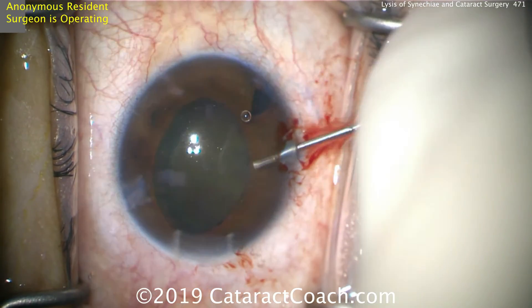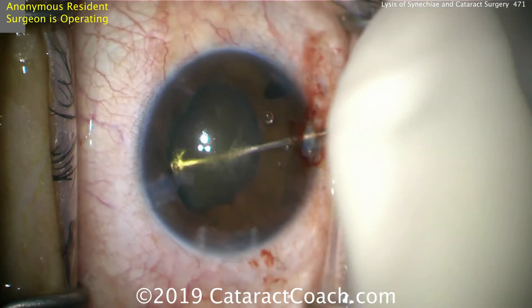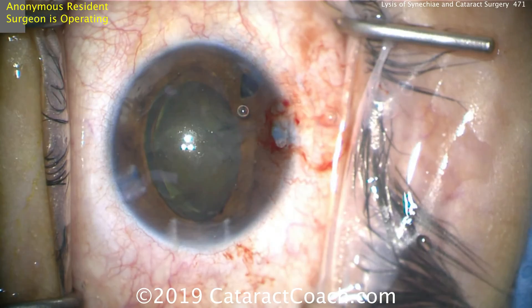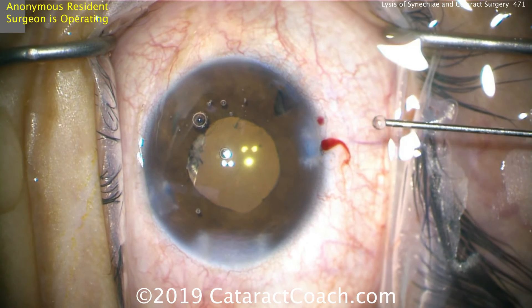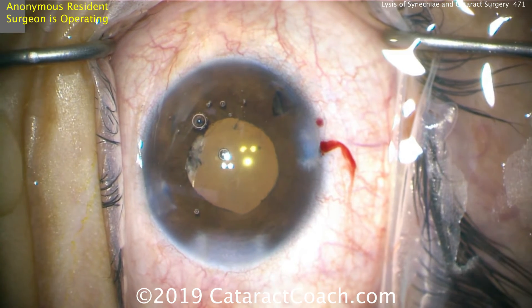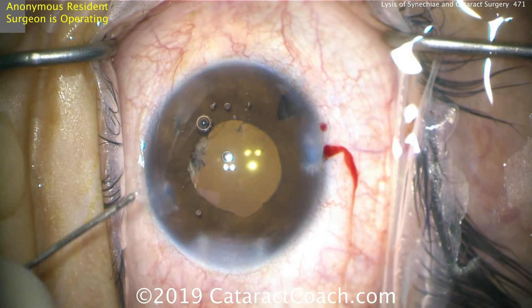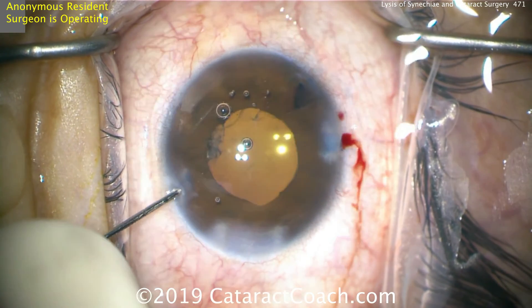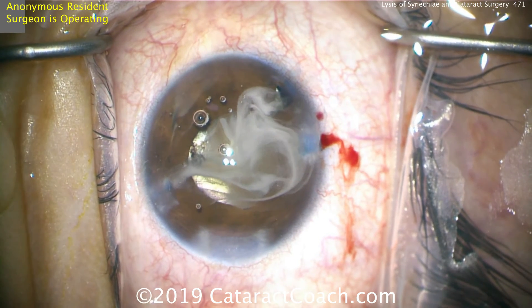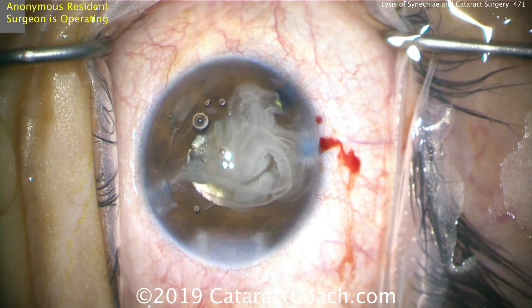Hydrodissecting out of the capsulorrhexis — let's really dial that nucleus up so it's held by the pupil and the iris at about the iris plane. That looks really good, and then it can be evacuated from the eye. Let's go to the end of the case. Sealing up the incisions — there's a little bit of membrane on the left side of the pupil, and we're going to leave that in this case, as it was very adherent and we thought it would do more harm than good to remove it. Putting some triamcinolone in the anterior chamber at the end of the case.